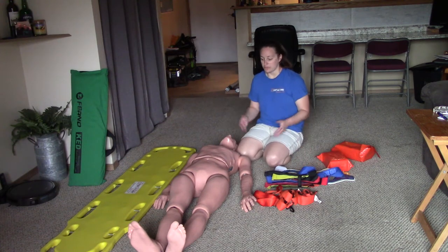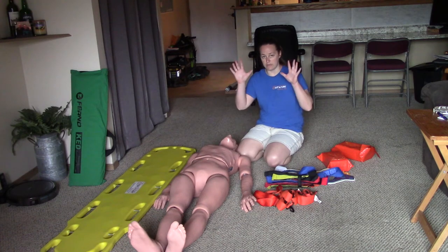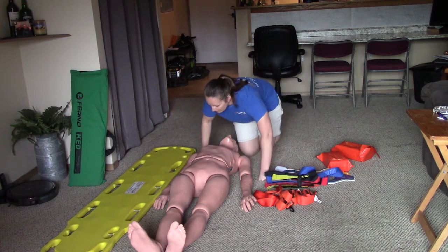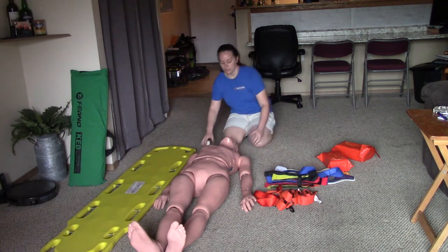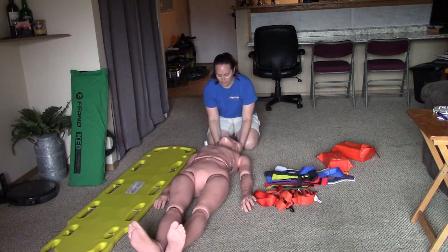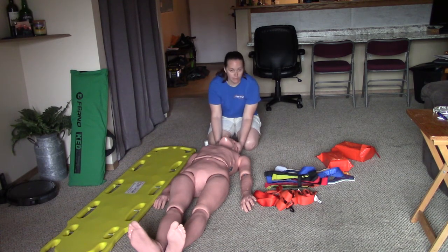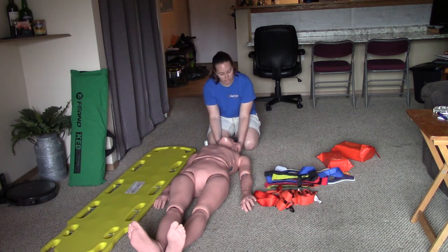When you start this station you're going to put on your PPE just like any other station, and ask your partner to hold c-spine. Holding c-spine means holding the patient's head in a neutral inline position — usually you'll just hold on to either side of the head, try not to cover up the patient's ears. For testing purposes we'll be verbalizing that someone is holding c-spine, so you'll have an imaginary partner holding c-spine for the duration of the station.